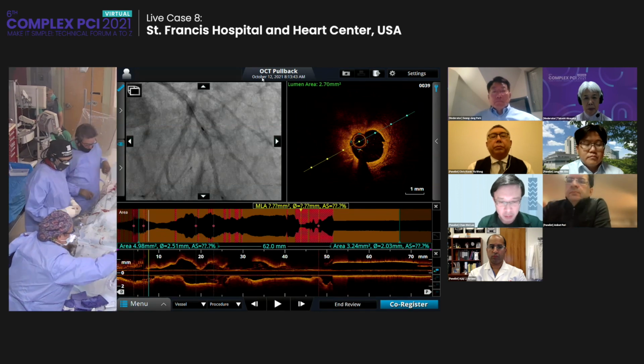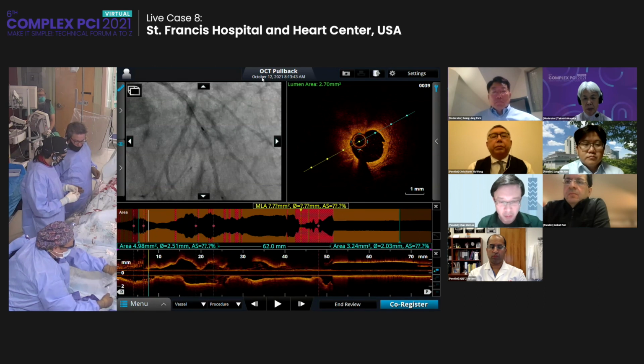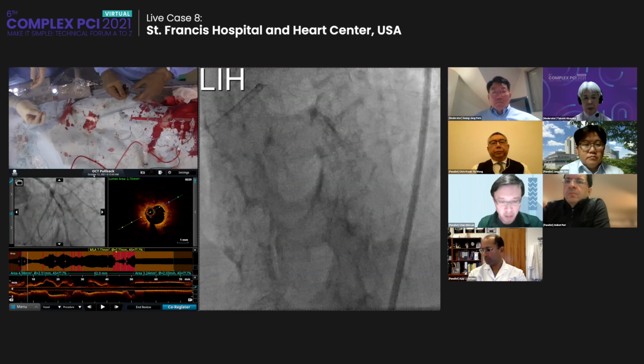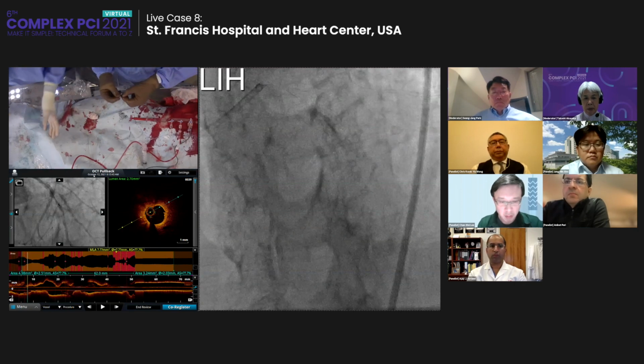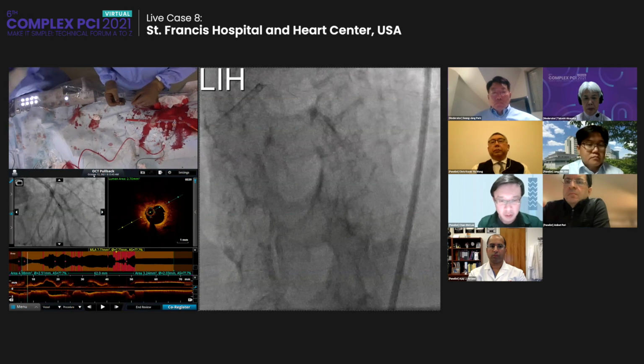Well, this is an example of where you may have even done an atherectomy, and then you might have been tempted to go ahead and just put in a stent. But clearly we're not ready or prepared to put in a stent. And I'm going to ask my team to just get their hands on a 3.0 Shockwave balloon. This was a 3.5, in case we need it. Yeah, but this, 3.0.